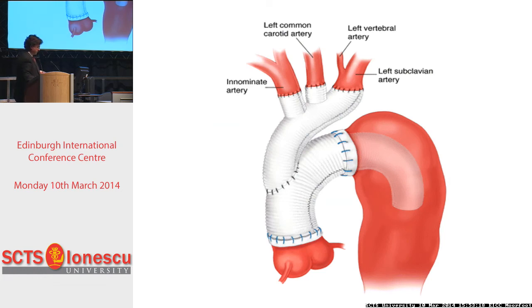This is one of the configurations for aortic arch surgery, similar to a case we did with Chris. It was a redo and very complicated. We had every possible combination of cannulation and drainage. But what you can do is use a graft with a sidearm, do this one as an island while we were on retrograde cerebral perfusion, then use the sidearm to switch to antegrade cerebral perfusion, and that gave us time to do 1-2 anastomosis, and then switch on to full cardiopulmonary bypass while we finished with this. So the possibilities are a lot. Just individualize and see what works best for you.